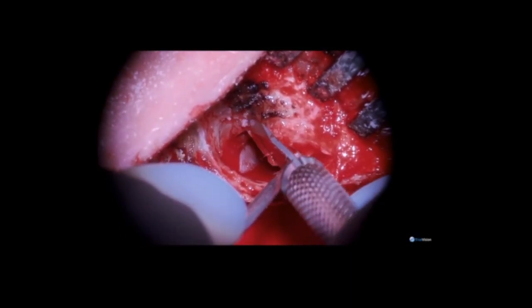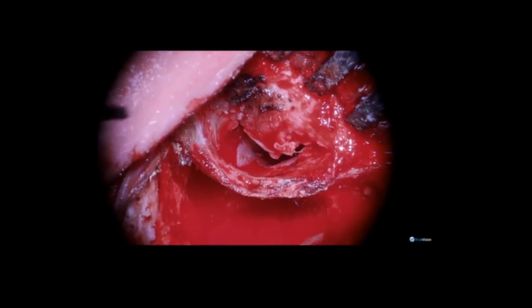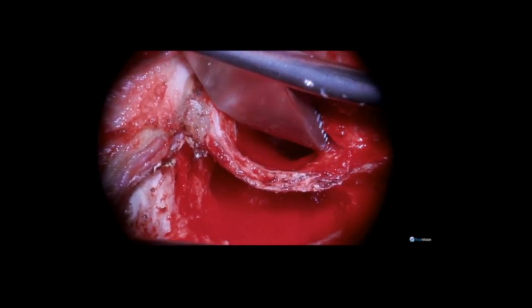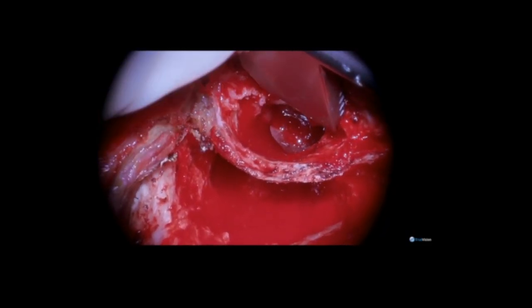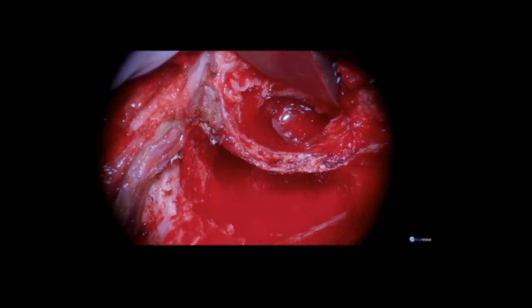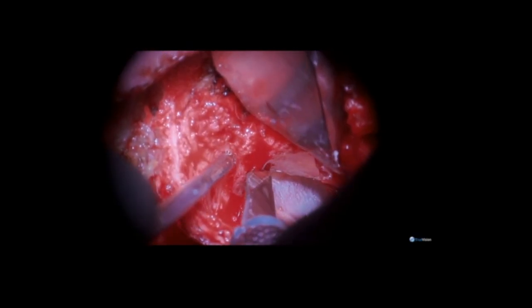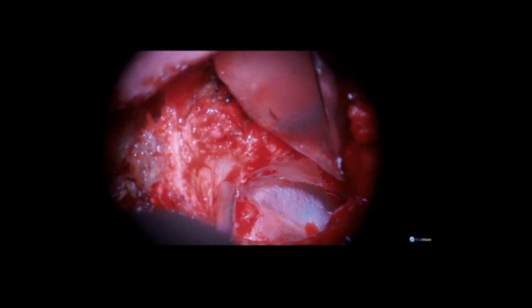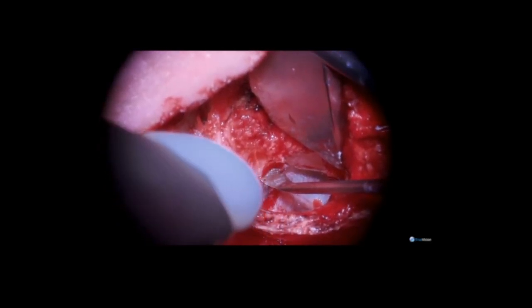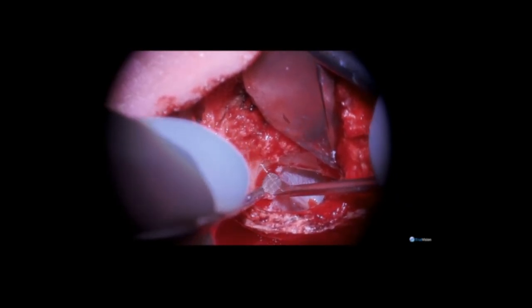Again, note the importance of performing the superior incision in a very anterior fashion. I prefer the use of a bladed Perkins-style retractor to move all of the tissue anteriorly to get a good view of the anterior canal wall skin, and then make an incision on the anterior superior aspect and create a small flap that can be elevated down and then replaced to cover up the cartilage graft during the reconstruction.